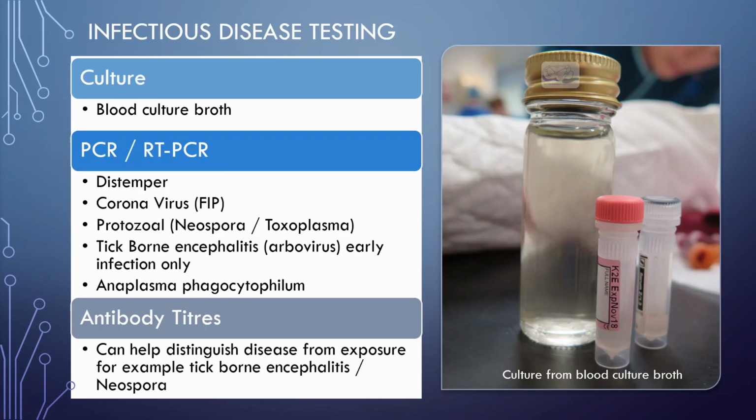Now, if I suspect a bacterial meningitis, then I normally put the CSF into a blood culture broth. And that is because it's actually quite difficult to culture organisms from the CSF as there is a low number of organisms. So you increase your chance, just as you increase your chance with blood, by putting it into blood culture broth. Not everybody does that. Sometimes the labs are a bit surprised by that, but that was what I was also always taught to do.